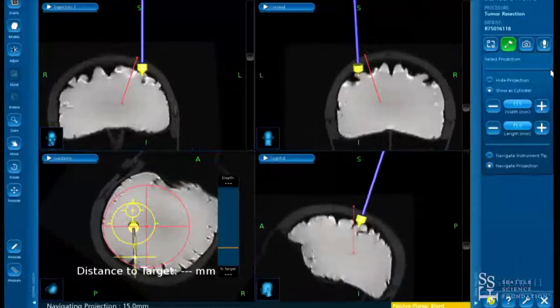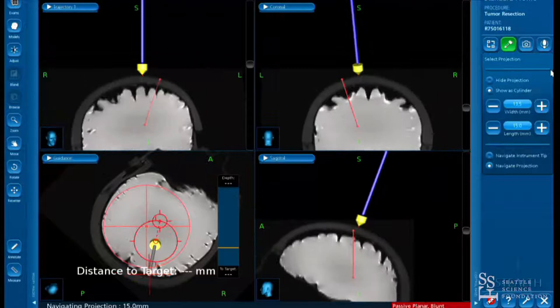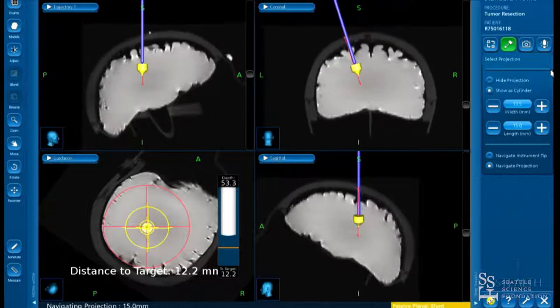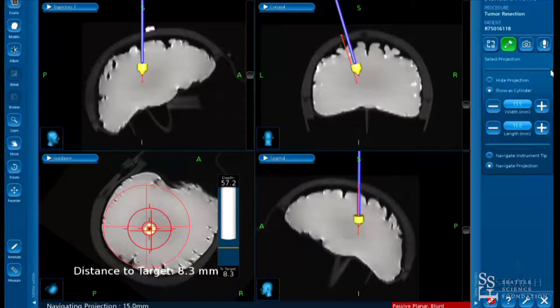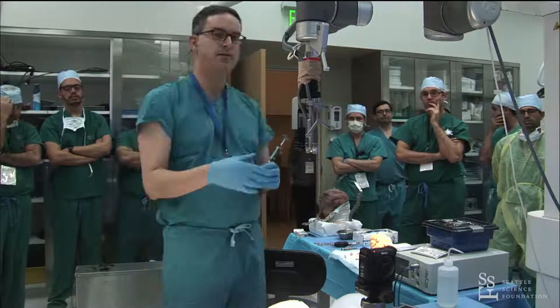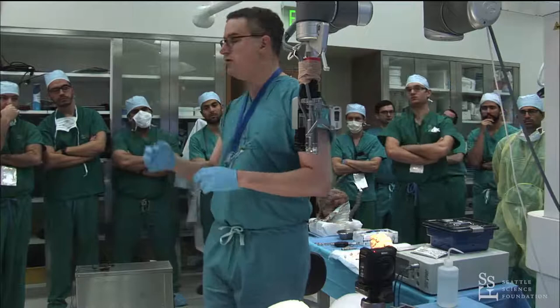The guidance view gives you crosshairs so you can align your trajectory from your entry point. When planning, you want to plan for a sulcal entry. For larger sulci you can see them on the planning station, but for younger patients you may not. One clue is to look for a cortical vein — veins tend to run right along the edge of a sulcus, not directly over a gyrus. Alternatively, get close to your entry point, open the bone, and then reset your entry point to be right in the sulcus.